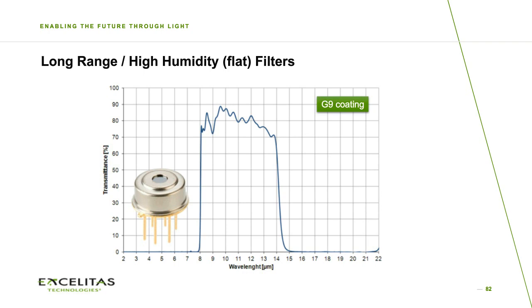If you look up the absorption of water vapor in air, this window fits nicely into the window in the air, so you have less distance dependency for long-range measurement. This is typically used for handheld pyrometers which have to measure over several meters distance. But again, I'm coming back to the application of a fever scanner.